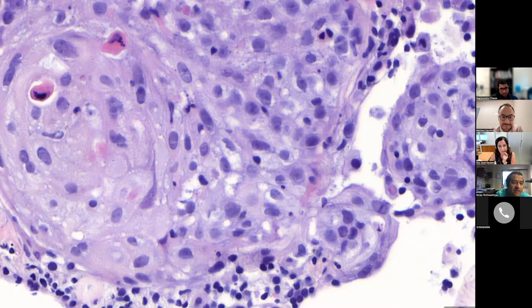Okay. You know, with these very pink cells. Cells with abundant cytoplasm. I really like the morphologic finding of cells that have relatively little cytoplasm, like there are on the right, and then the cytoplasm keeps increasing as you go towards the left. I think that's a very good marker of squamous differentiation. A corneous pearl is forming here.